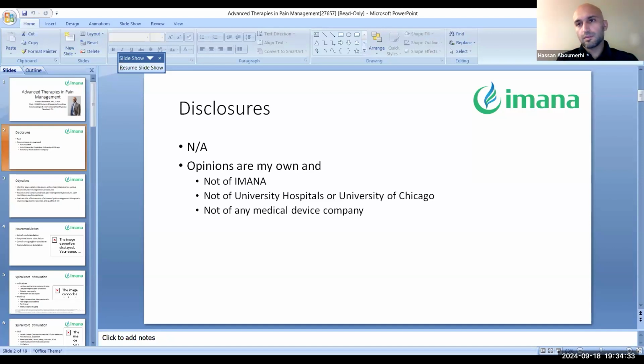So the first big topic that we're going to talk about is neuromodulation. And I'll say up front, all the things that I'm talking about can be and are usually performed on an outpatient basis. Again, most of which, with clinical exceptions, are also done under MAC with the goal of trying to avoid general anesthesia as well, and basically making recovery as smooth and efficient as possible, again, with clinical exceptions. So neuromodulation basically refers to the use of electrical energy to modulate the nervous system peripherally or centrally to try and produce a clinical result.